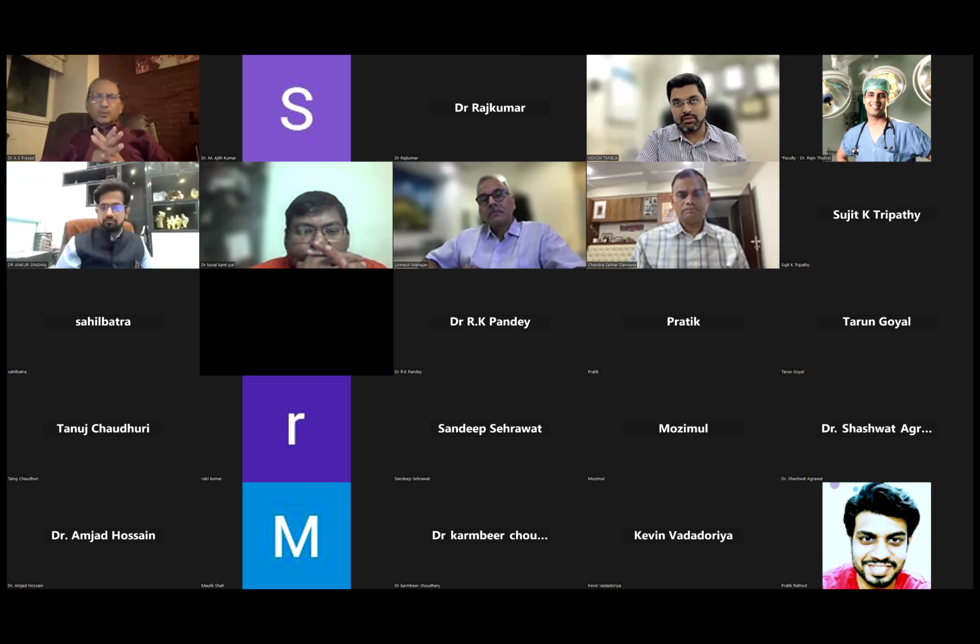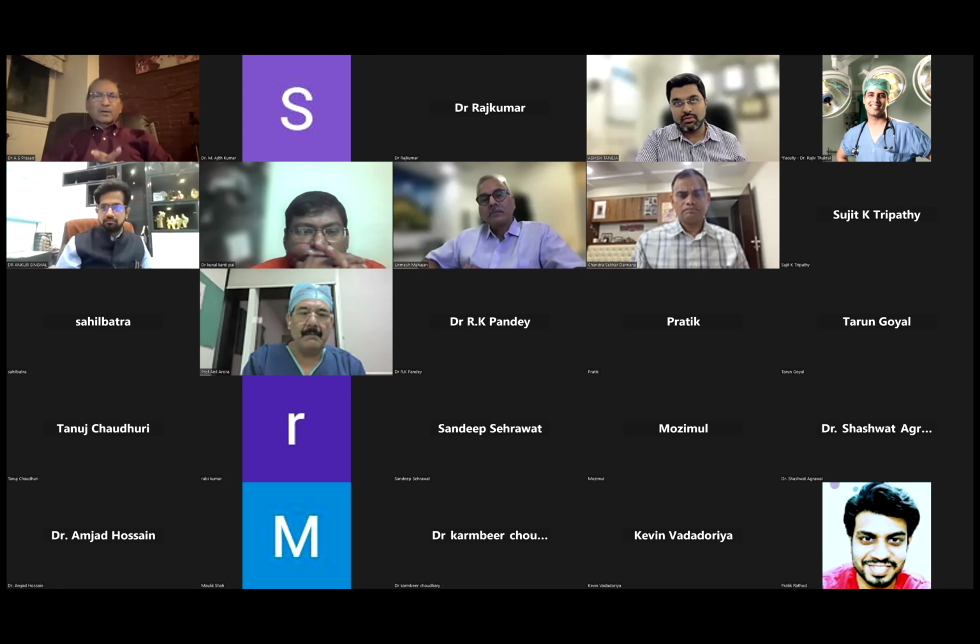So, Dr. Prasad, one question for you. What's the sequence of removal of implants, sir? Do you have any particular sequence, tibia first or femur first, or what would you suggest? Ideally, the first thing is to remove the insert, as Dr. Anil Arora said, then we can get a lot of space. Then usually I remove the femur, because we have a tibial support, and I try to remove the femur first. That takes most of the time. Tibial removal is usually simpler, and I'll keep it last.